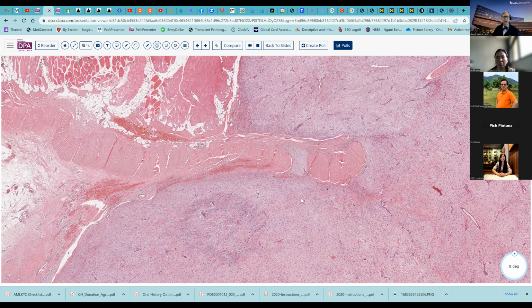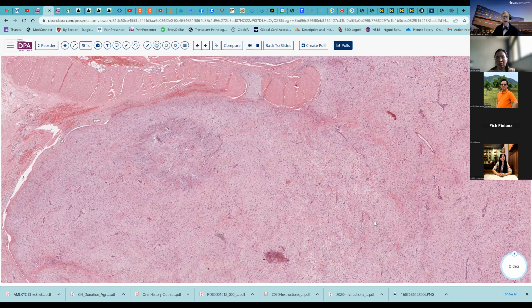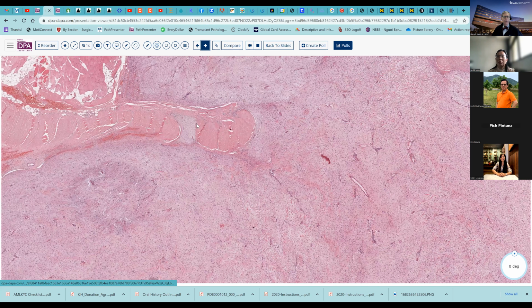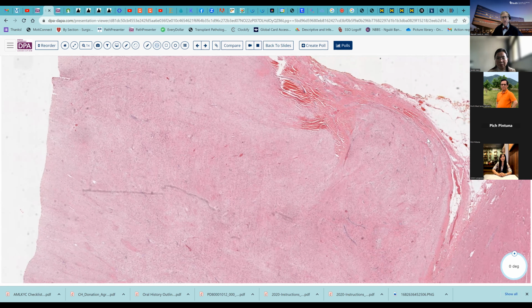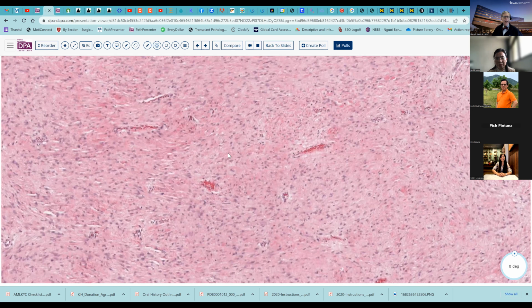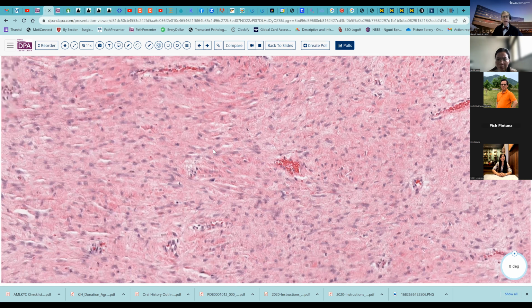This can increasingly be treated with various medications or targeted therapies that can make it easier to manage. Here's another example, again, right abutting deep skeletal muscle, and you see a very similar pattern. Rounded, circumscribed margins, low vascularity, very bland looking spindle to ovoid cells, stellate cells, and a collagenous matrix.